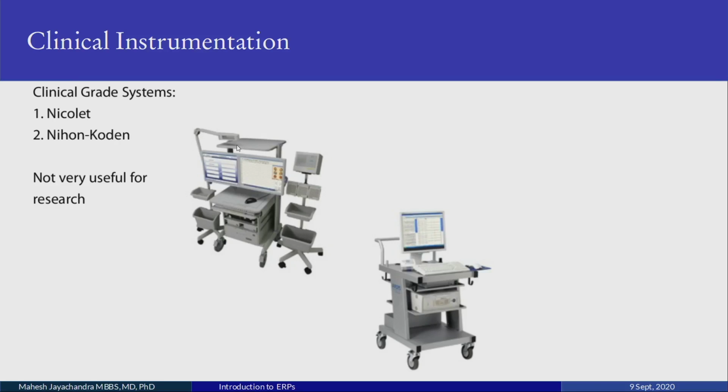You have pre-made evoked potential stimuli, mostly auditory evoked potential, visual evoked potential, and somatosensory evoked potential. And that person sits over there, punches a few buttons after placing the electrodes and gets the data. But they're very good clinical systems. They can take a lot of abuse in the clinical wards, and in hospitals, if they have ERP or EEG setups, it's one of these or something similar.